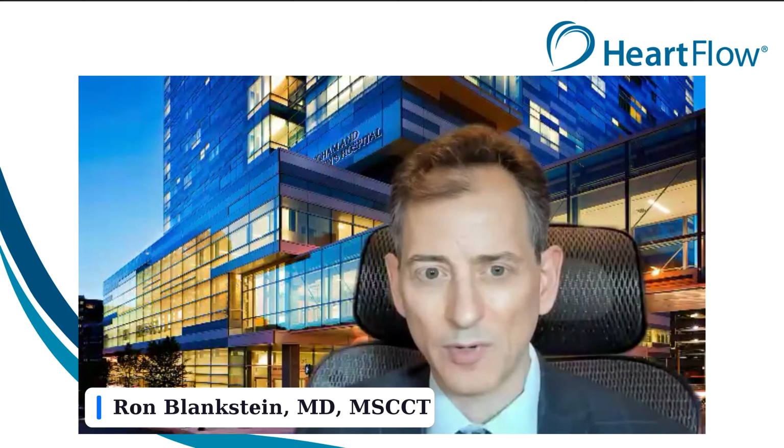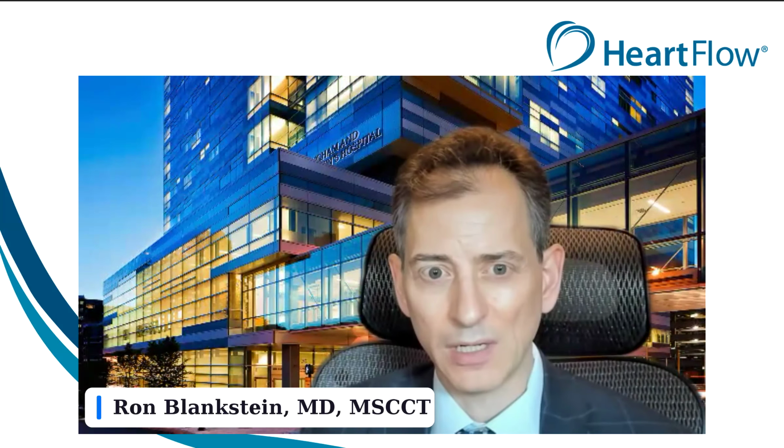We have to look at both. The absolute risk, at least in the short term, is going to be the absolute amount of plaque, but the relative risk and the long-term risk is going to be more informative to look at the percentile. Thank you. That's really exciting, and I think particularly if you're thinking prevention and understanding treatment response, it's going to be highly important, as you point out.